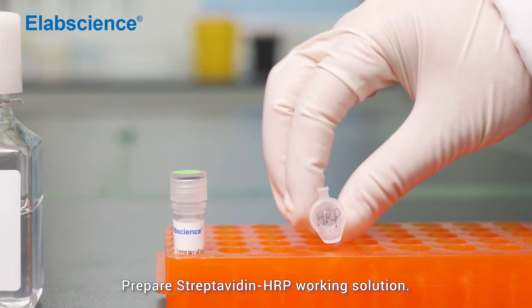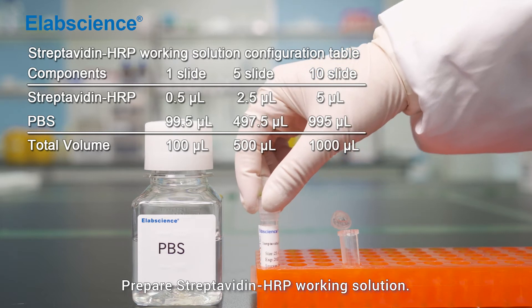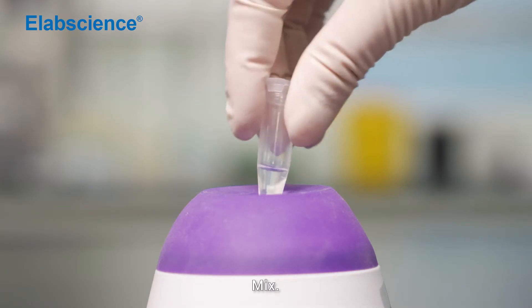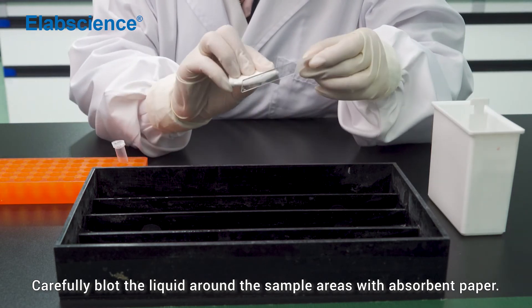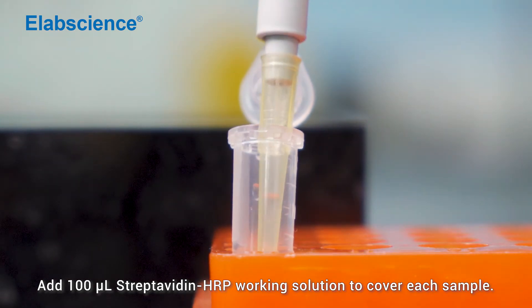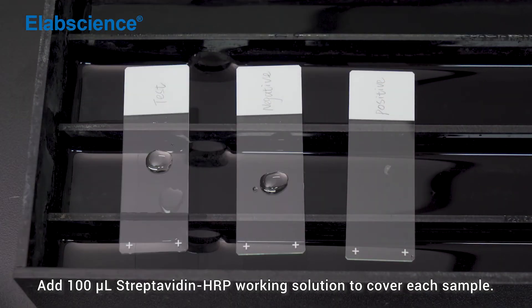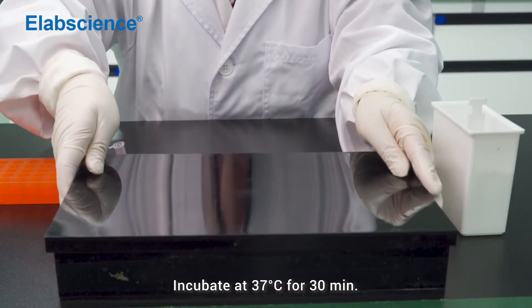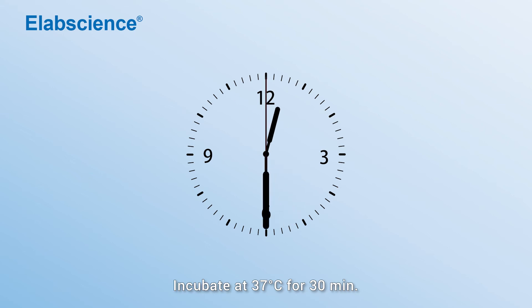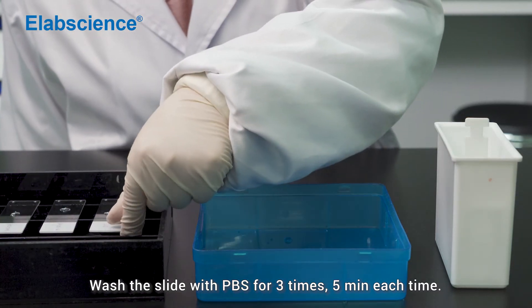Prepare streptavidin-HRP working solution. Mix. Carefully blot the liquid around the sample areas with absorbent paper. Add 100 microlitres of streptavidin-HRP working solution to cover each sample. Incubate at 37 degrees for 30 minutes. Wash the slide with PBS for 3 times, 5 minutes each time.